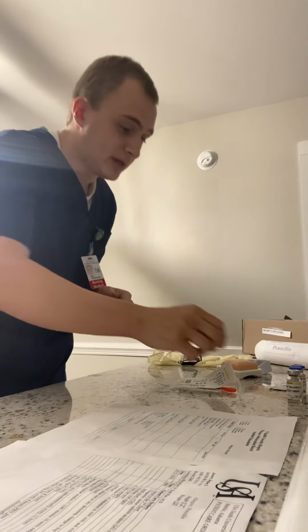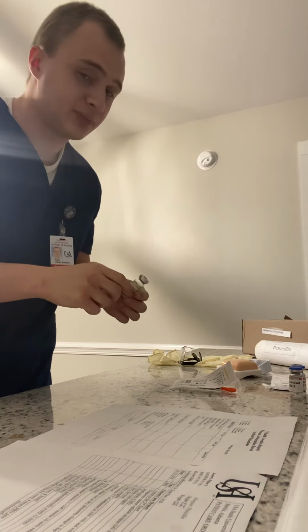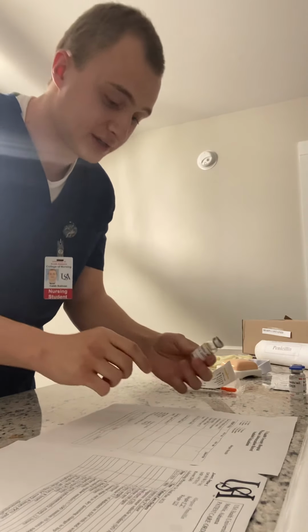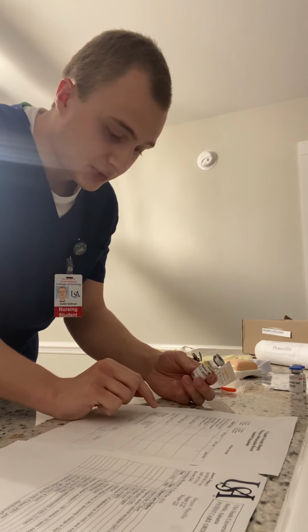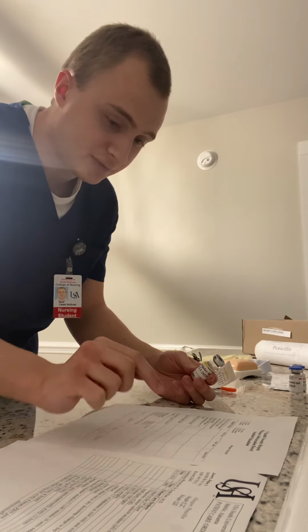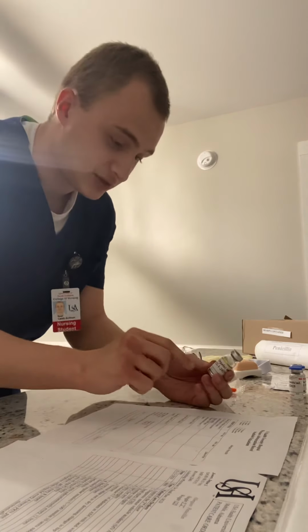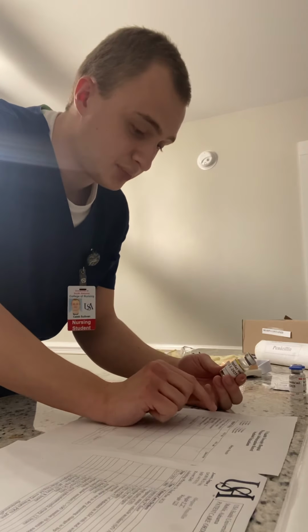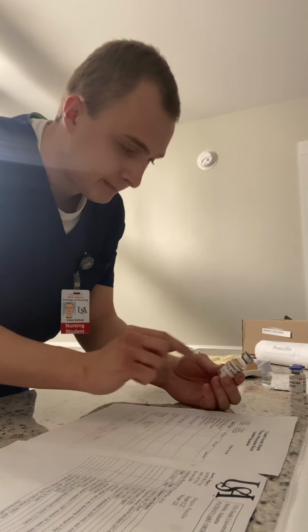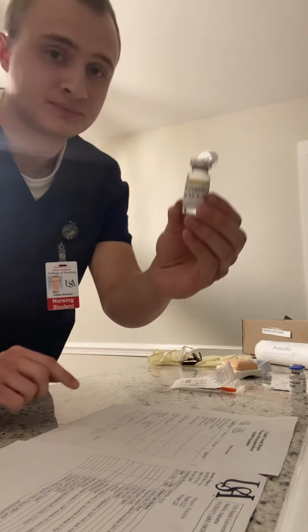And I would grab the right vial of medication according to the MAR. As I begin to prepare for my first check of accuracy, I'll again check, making sure I have the right patient, Jaguar J. Jones, medical record number 4176352, and the right medication, Novolin R, 100 unit per milliliter insulin, or regular insulin, and check the expiration date, which is 12/1/2025.